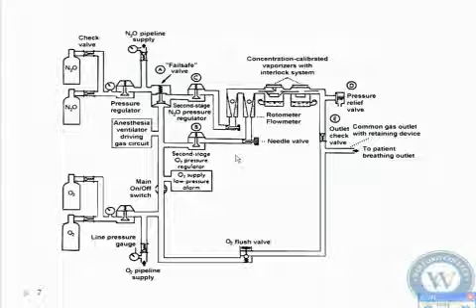All right, so there's 2 ways to prevent that. One is internally with this valve right here, called the fail-safe valve. This thing works on pressure. So as pressure comes through this tube here, doesn't matter what the pressure's from, it's running at about 50 psi now. It's going to come in, and from the bottom up, it's going to help push this valve up. Okay, so this diaphragm right here on this valve is elevated. And when this is elevated, it's going to allow nitrous to come and seep in. And so they'll combine right here.